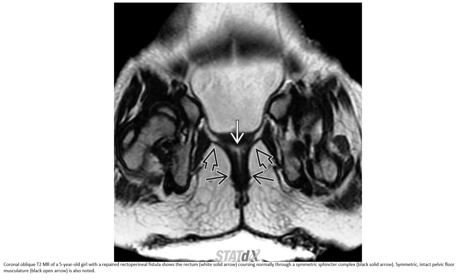Coronal oblique MRI in a five-year-old girl with a repaired rectoperineal fistula shows the rectum coursing normally through a symmetric sphincter complex. A symmetric, intact pelvic floor musculature is also noted.